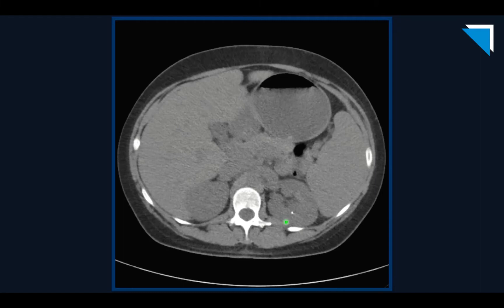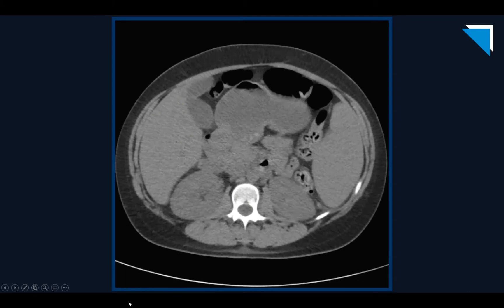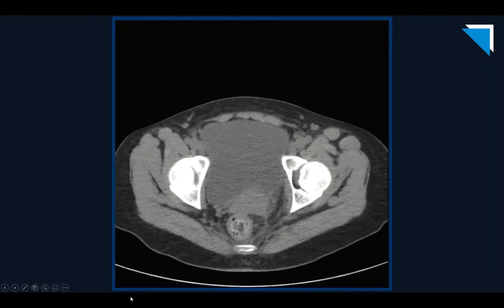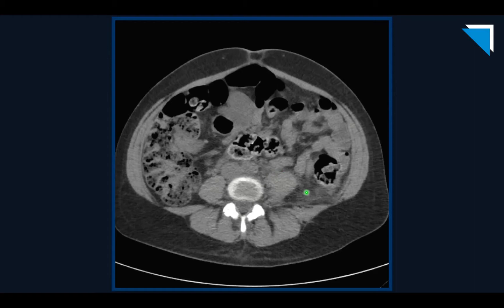The patient has non-obstructing left nephrolithiasis with a single left renal calculus and no left hydronephrosis. If we track the left ureter, we see no left hydroureter and no left ureteral calculus. However, we see infiltration of the left retroperitoneal fat with ill-definition of the left psoas margin.